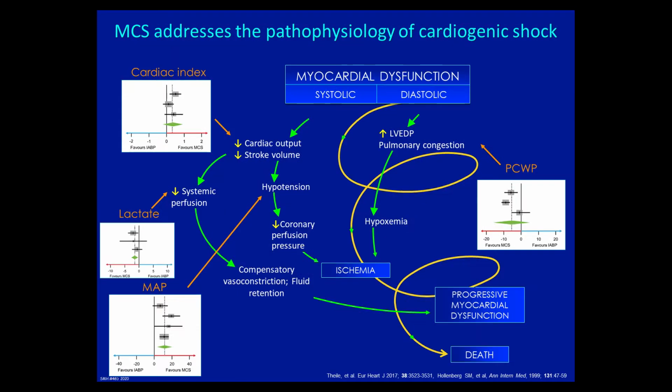So this really addresses the pathophysiology of cardiogenic shock. This is a color version of the little diagram we put together 20 years ago. And Holger Thiele actually made this graph, took the studies of the pumps, and he looked at what they do. So they do all the things you'd want to do in addressing the pathophysiology of cardiogenic shock.